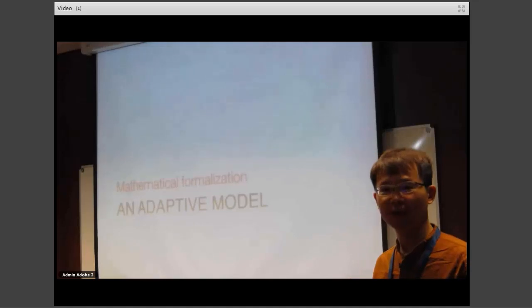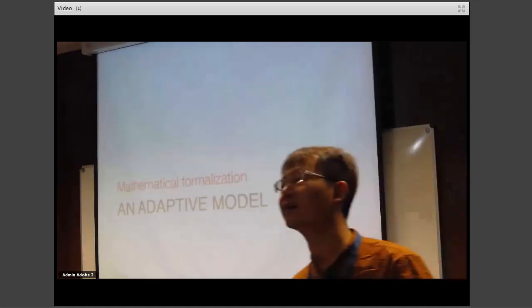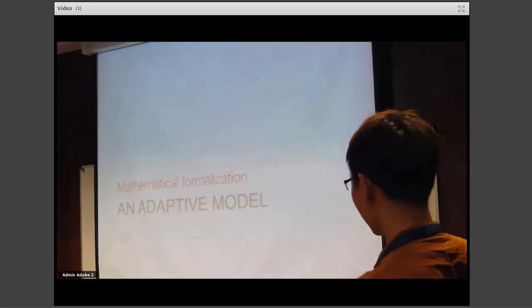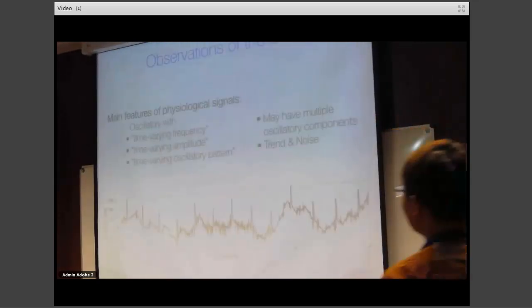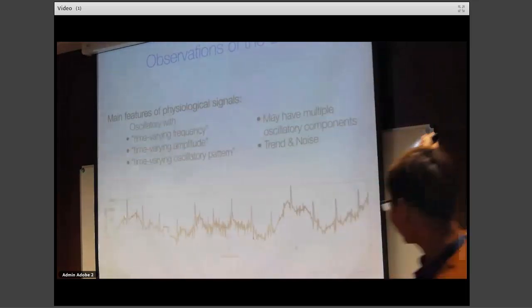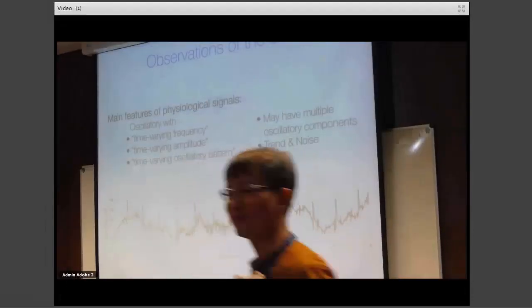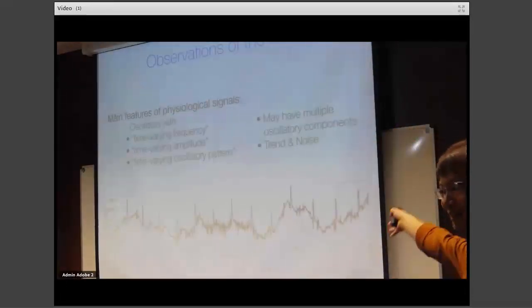So I'll briefly tell you the model, and this model will give you an intuition of what we are doing and why we found it important. First, look at the signal. Maybe not daily nowadays, you look at CTG, but I believe someday, with Rick's and many Philips, GE's efforts, you will read this kind of signal every day.